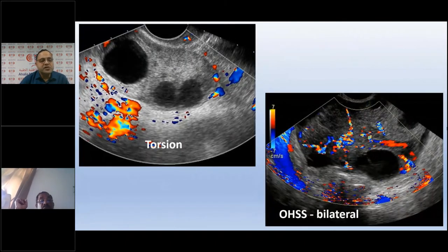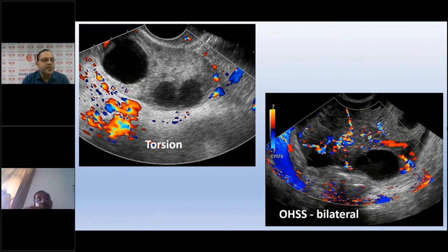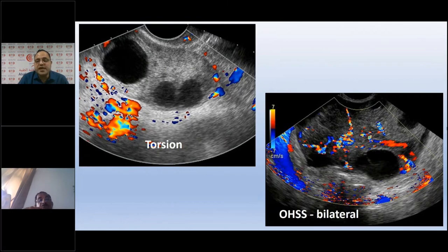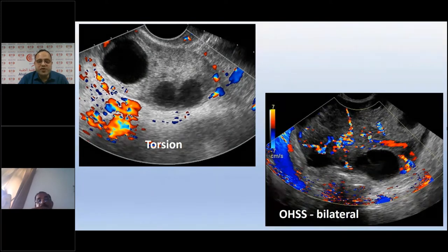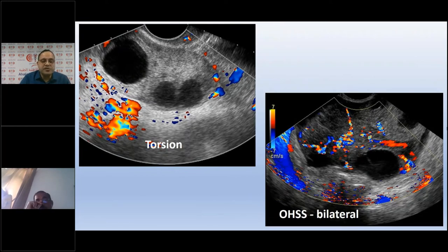Large simple fluid collections in torsion should not be confused with multiple cysts of ovarian hyperstimulation syndrome. In OHSS, the ovary is large with multiple cysts but flow is very much present and the condition is bilateral — distinguishing it from torsion where flow is absent.